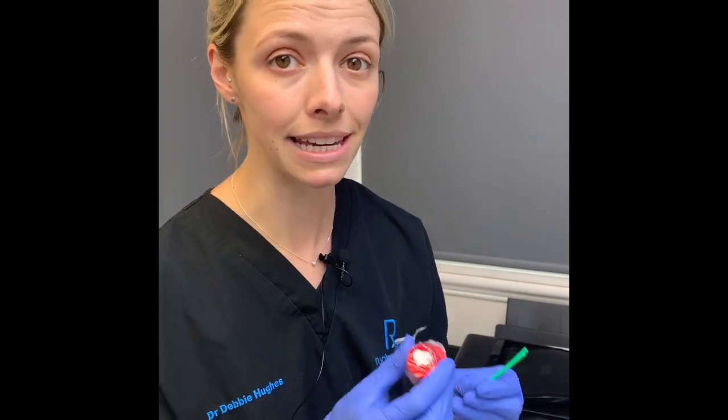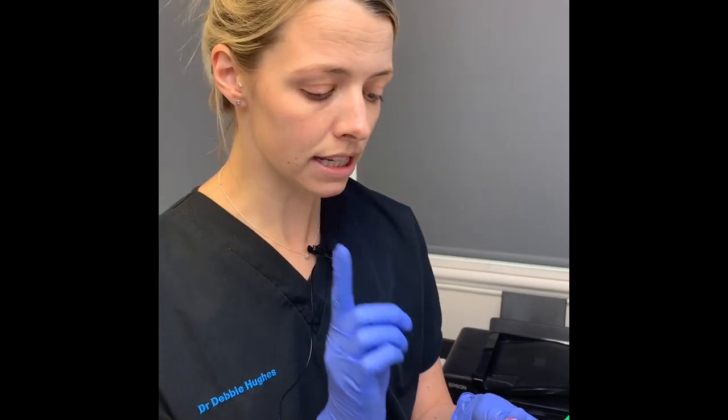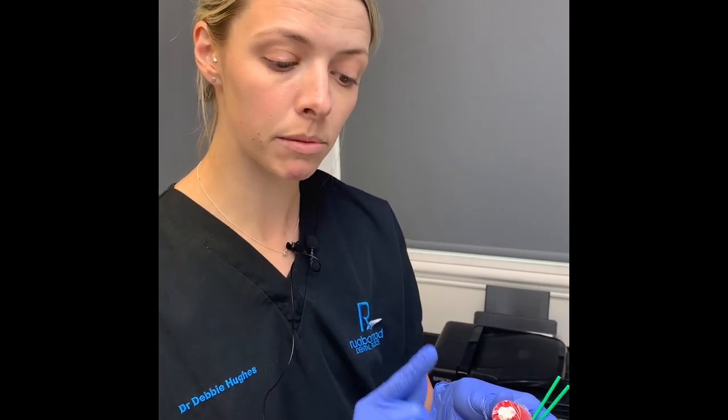The really important thing is that before this sets, you need to make sure you can still bite your teeth together. Once you've rolled this into the tooth, get a little bit of Vaseline on your finger and rub it all over the tooth and the filling so that it's nicely sealed, then have a few bites together just to make sure your teeth come together naturally.